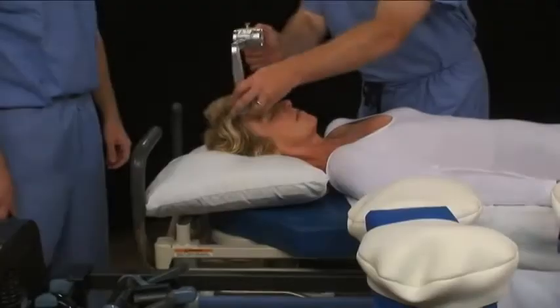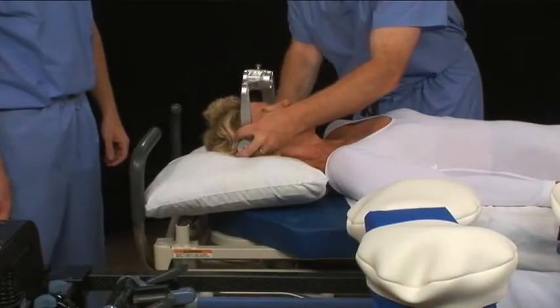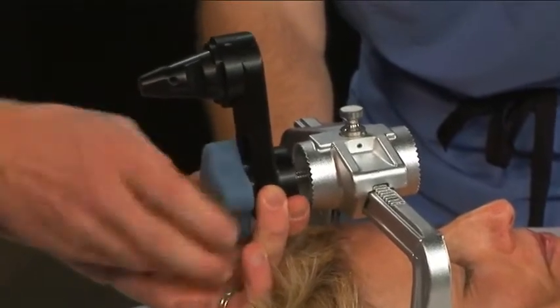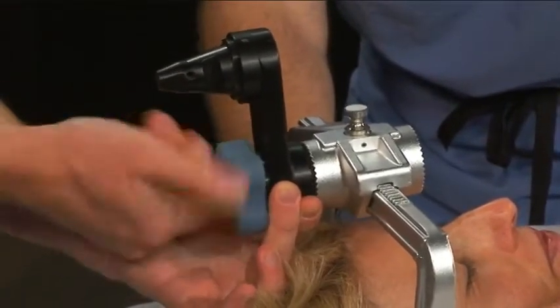There are two methods for attaching a skull clamp to the C-Flex. The first step for both methods is to attach the skull clamp to the patient's head following the manufacturer's instructions. In the first method, attach the starburst adapter to the skull clamp while the patient is still supine on the stretcher.